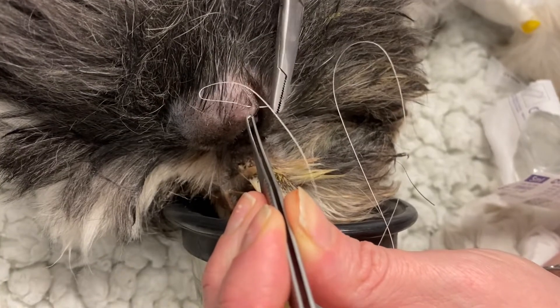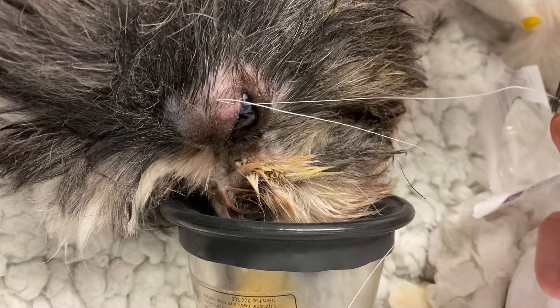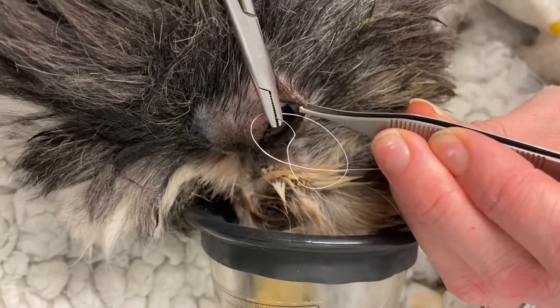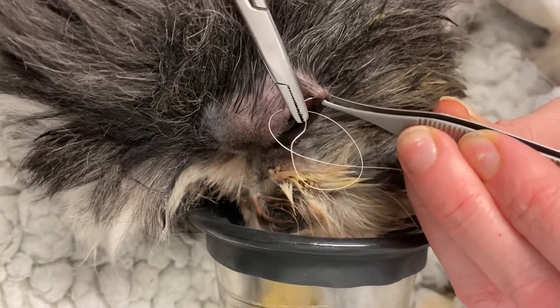One additional thing that you can do in these patients is place a temporary tarsorrhaphy, so just closing and reducing the size of the eyelid margin. That will depend on the individual patient.